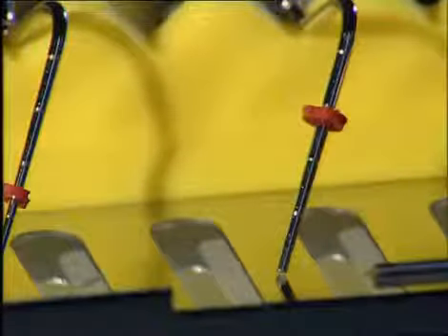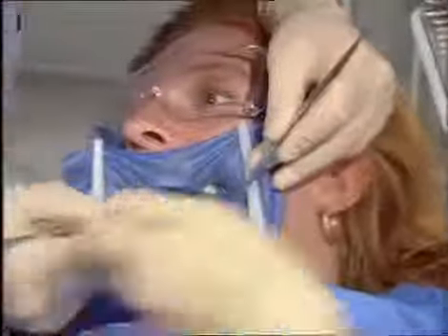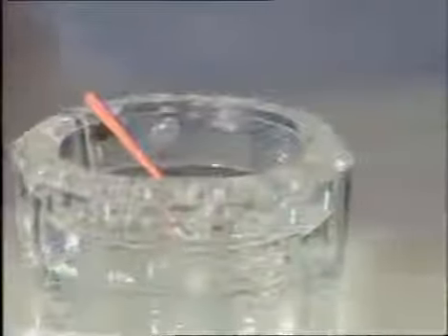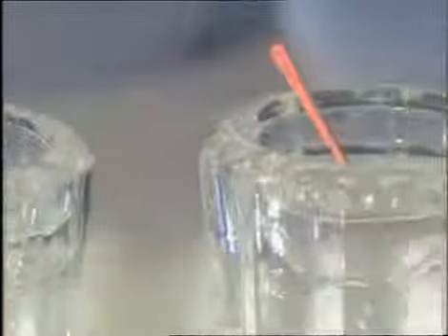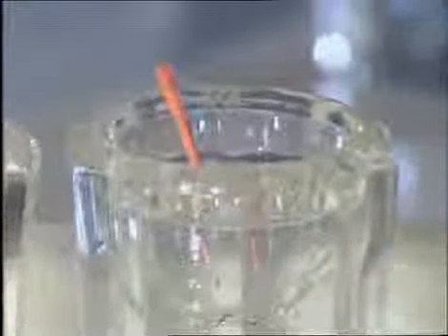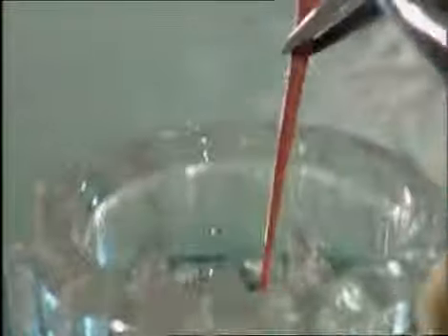Pluggers are selected whose diameter is just slightly less than that of the canal at any given level. Three pluggers are used for any one root canal preparation. They are pre-fitted to the desired length. The largest diameter plugger must work passively, unimpeded by dentinal walls over a range of a few millimeters in the coronal third. A smaller diameter plugger is chosen that can work effectively in the middle third, and the smallest plugger is selected that can work easily to within 5 to 7 millimeters from the canal terminus.